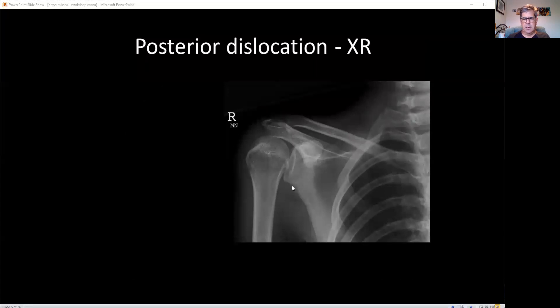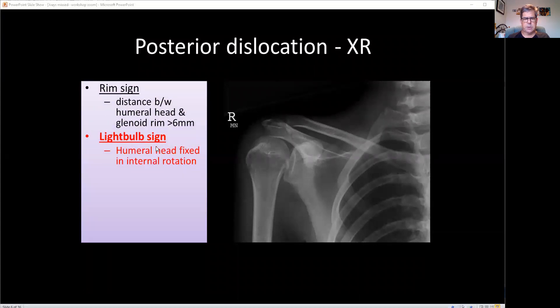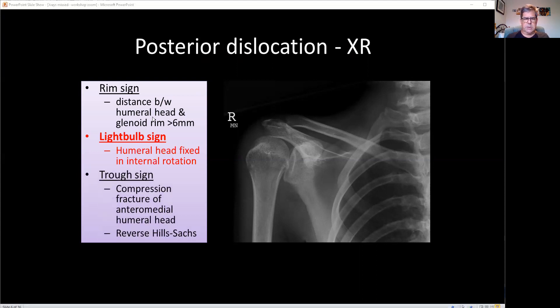It is, of course, a posterior dislocation. The classic sign is the light bulb sign — because it's internally rotated, the greater tuberosity is rotated internally and has the appearance of an ice cream cone or a light globe. There are a few other signs, but the light bulb sign is the one we most notice. It's fixed in internal rotation, so you shouldn't really miss it if you examine the patient. A few other signs are about 60–70% sensitive. The rim sign — more than six millimetres — and the trough sign, like a reverse Hill-Sachs injury.